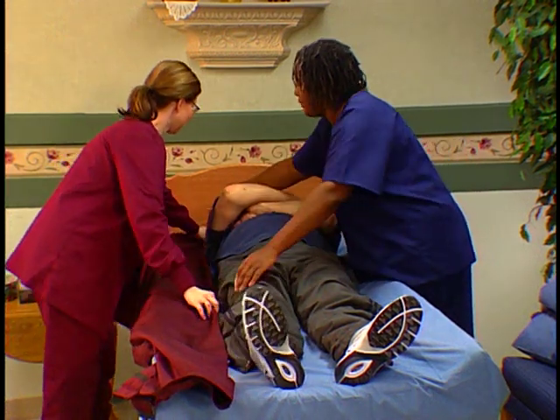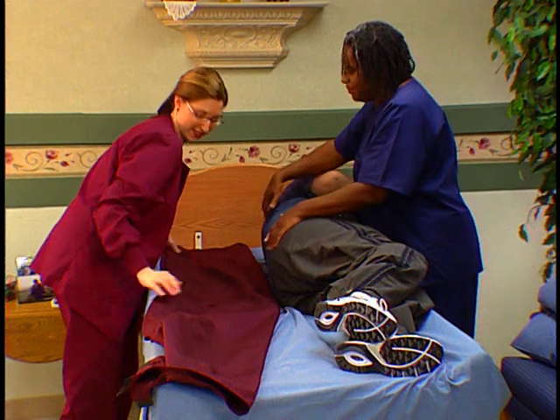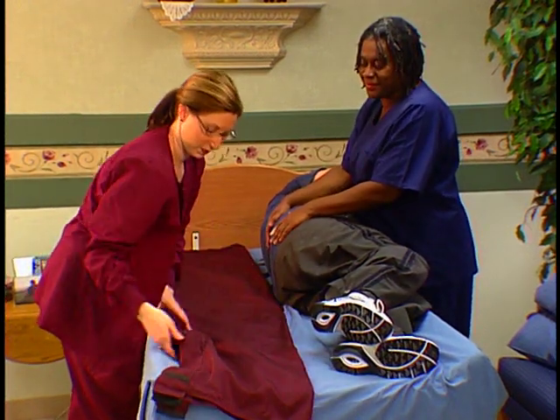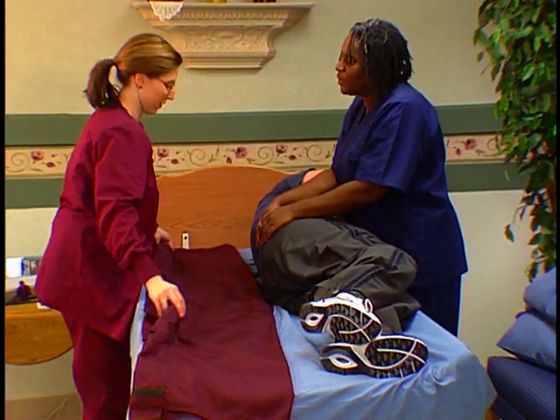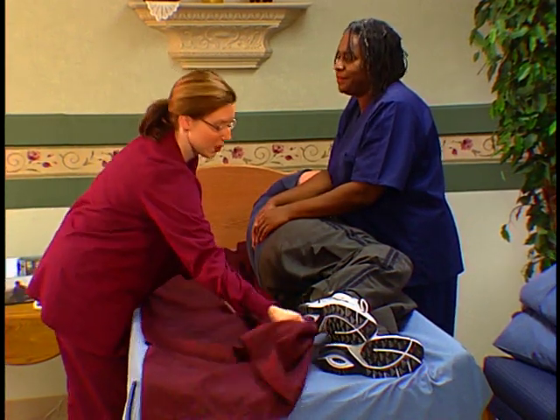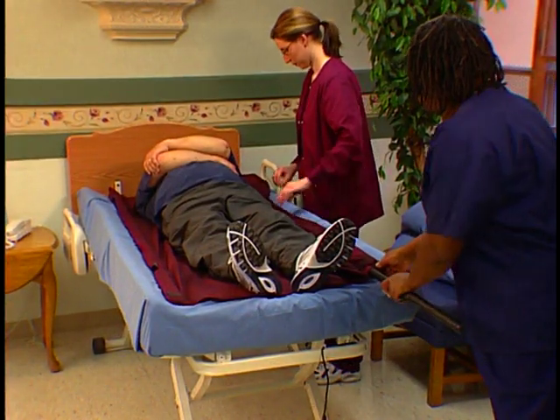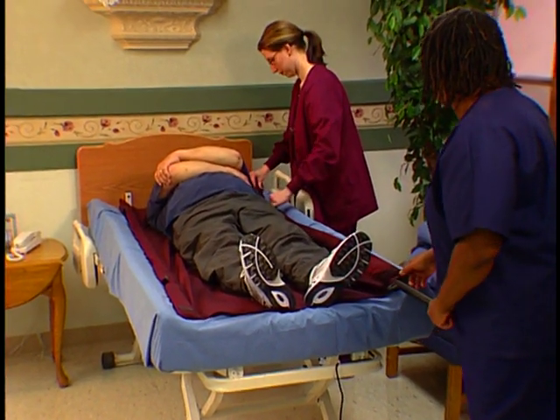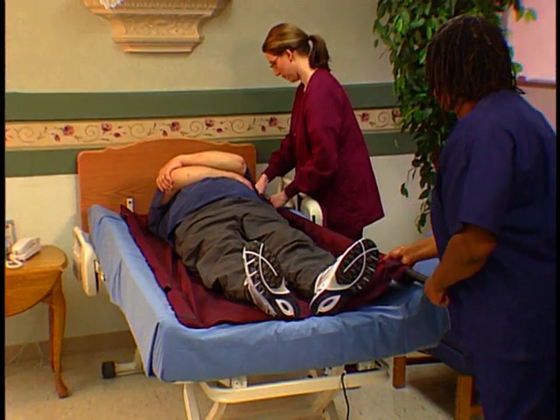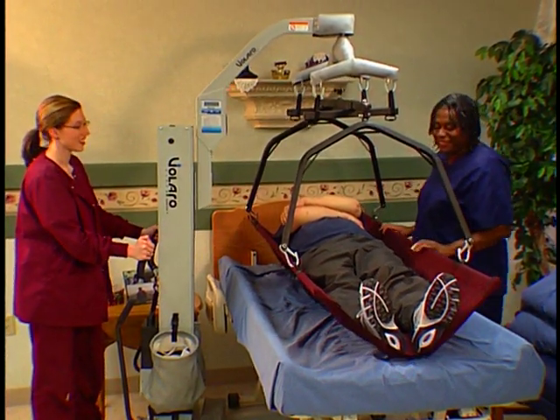Fold the sling. Roll the person on one side, tucking the sling close to the body of the resident. Position the sling so it lies above the resident's head and below the feet. Roll the resident back and pull the rest of the sling through, straightening any wrinkles. Install each stabilizer bar into the sewn-in pocket on the side of the stretcher sling. You are now ready to transfer.